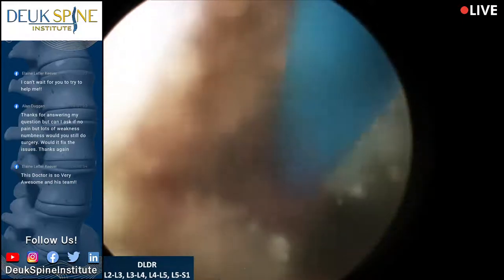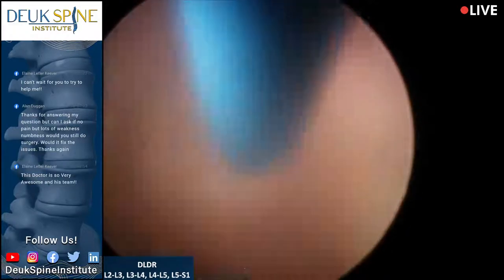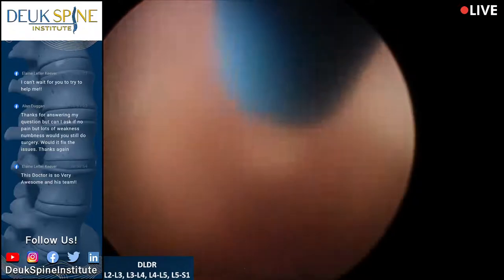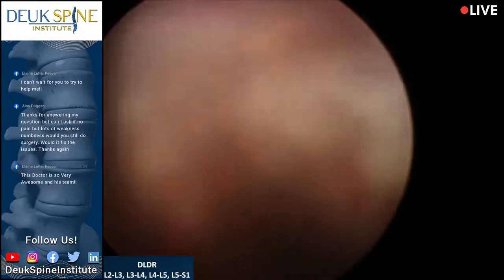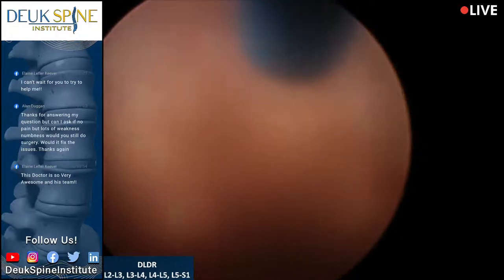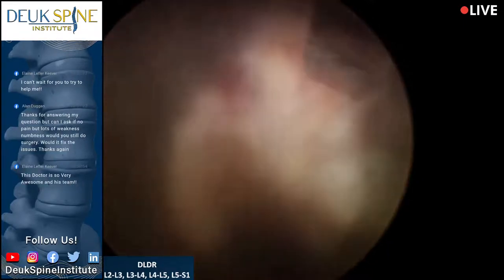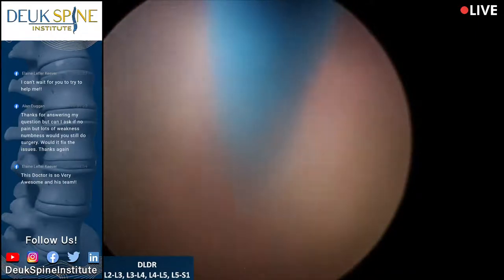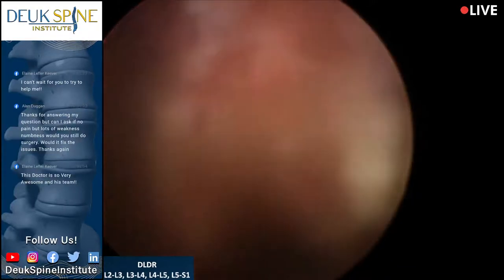What do you have the laser on? What's the setting? 3.5 and 15. Is that maxed out, Luis? Yes. Yeah. That's what I've been doing. Seems to be working nicely. All right, done.